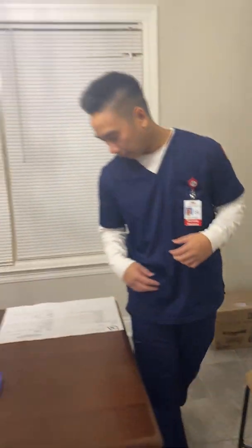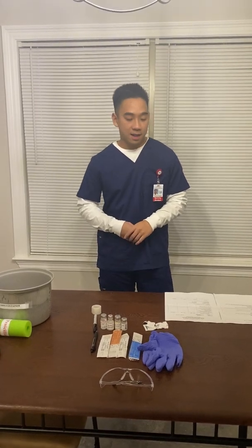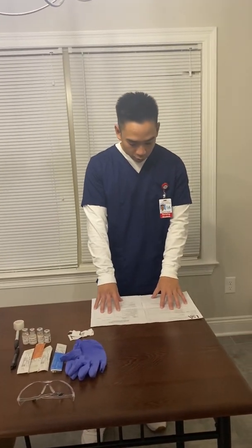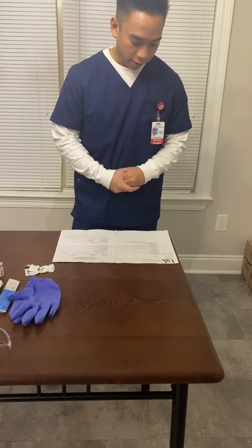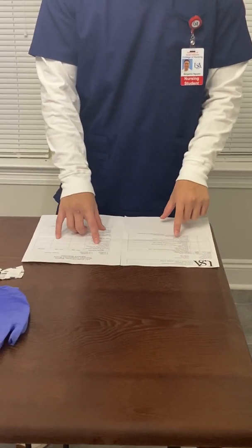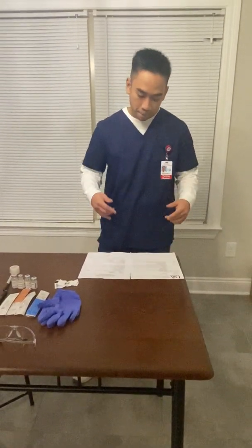All right, so the first thing I'm gonna do is just verbalize that this is a no interruption zone, no text messages, no phone calls, anything like that. The next thing you're gonna do is come and verify your order on your MAR and your chart. So it's here that you're gonna identify the 5 rights. So this is Jaguar J. Jones, Heparin, 5,000 units, subcutaneously, every 12 hours.